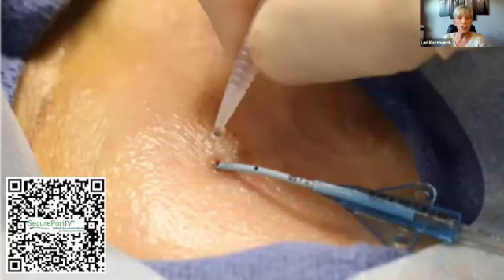The benefit, in terms of skin integrity, is that this is used on micro preemies. I think our youngest is probably 22 weeks on up. They use it on umbilical catheters. So it's run the gamut of safety across all patient populations. The way you take a dressing off now, whether it's walking it off with an alcohol or CHG prep, or maybe even an adhesive remover, whatever you do to protect that skin, it's always essential to do that. And tissue adhesive should not change that process.